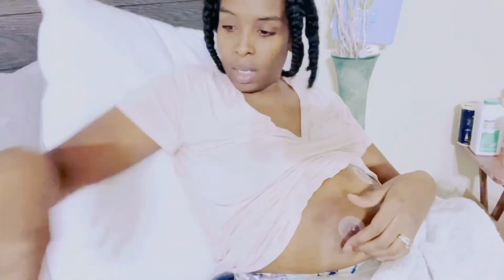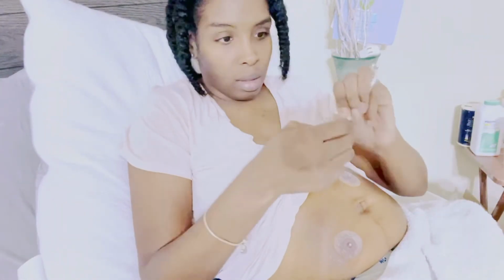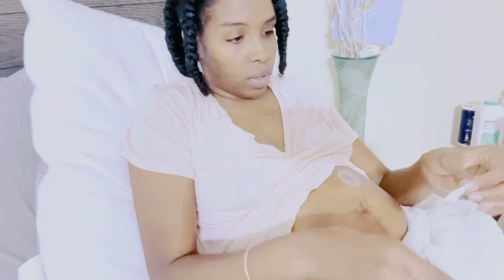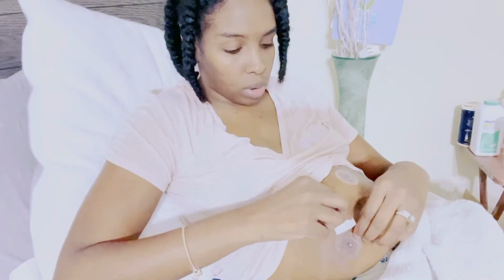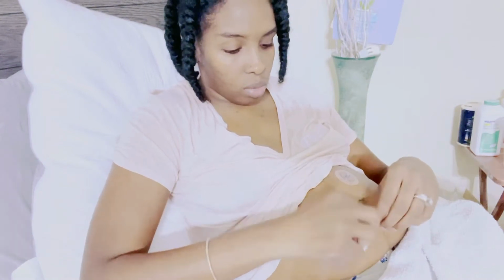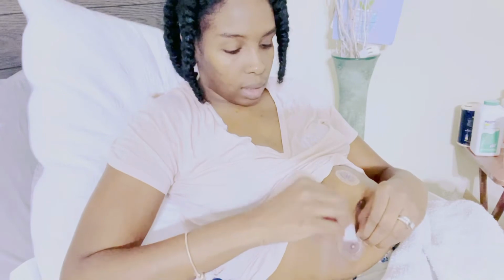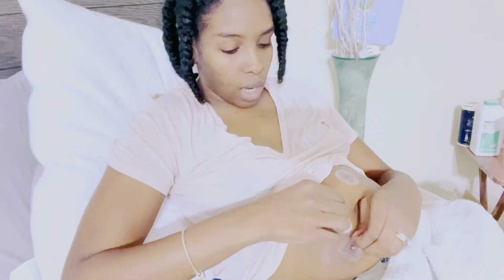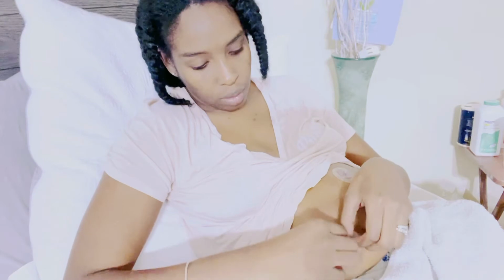Sorry, y'all. I also don't like to leave my catheter or my tubing out too long exposed to the air, because it goes inside of my body. Oh my goodness. I got carried away. I just wanted to get the needle part over. That is so funny. So I just take this little wipe here.